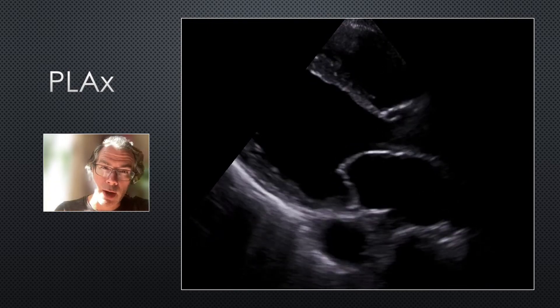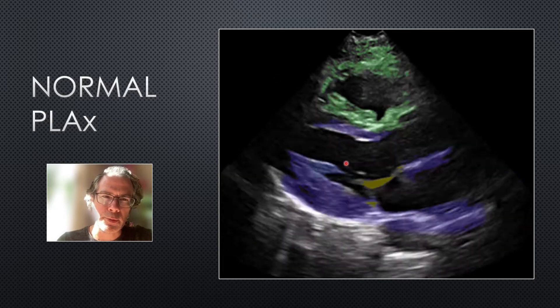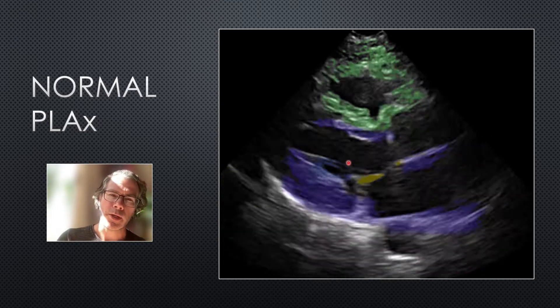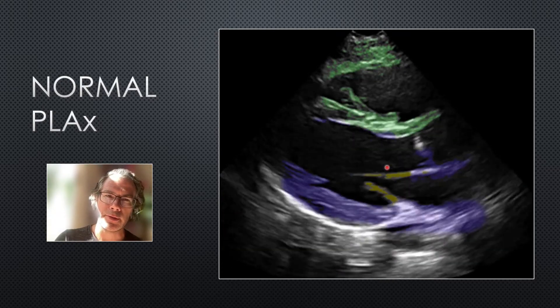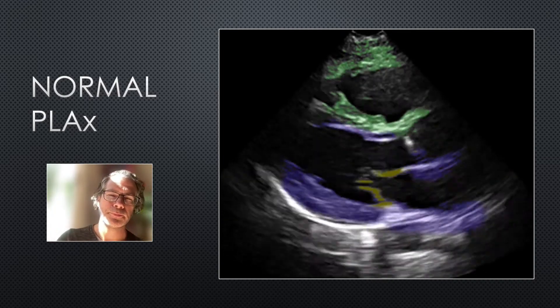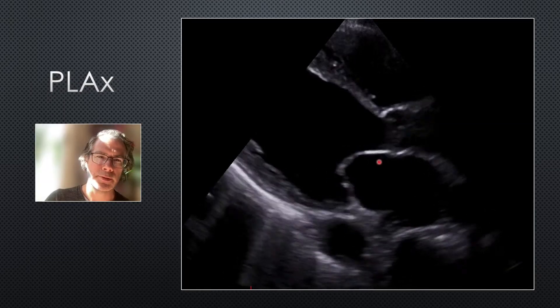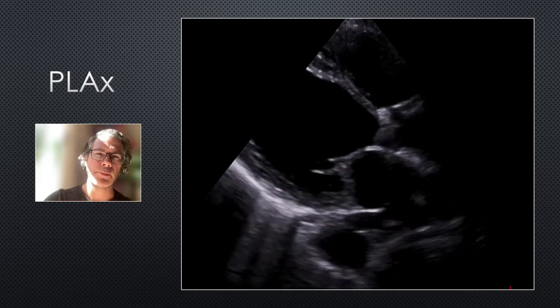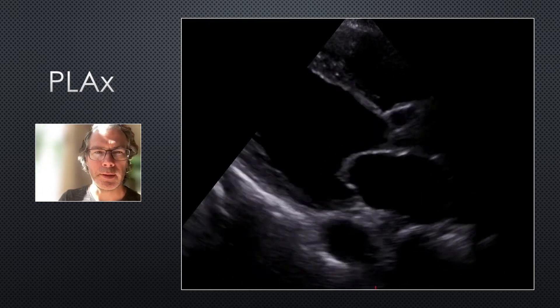Here's a normal parasternal long axis for comparison — the walls are coming in by a third and thickening during systole. Another thing to note is the mitral valve: the anterior leaflet should slap up into the septum. If it leaves a big gap, that's a sign of impaired LV function. Going back to our case, here's the anterior leaflet and the septum — there is a big gap. That anterior leaflet is not slapping up into the septum and is not getting anywhere close to it. This is a useful marker of impaired LV function.